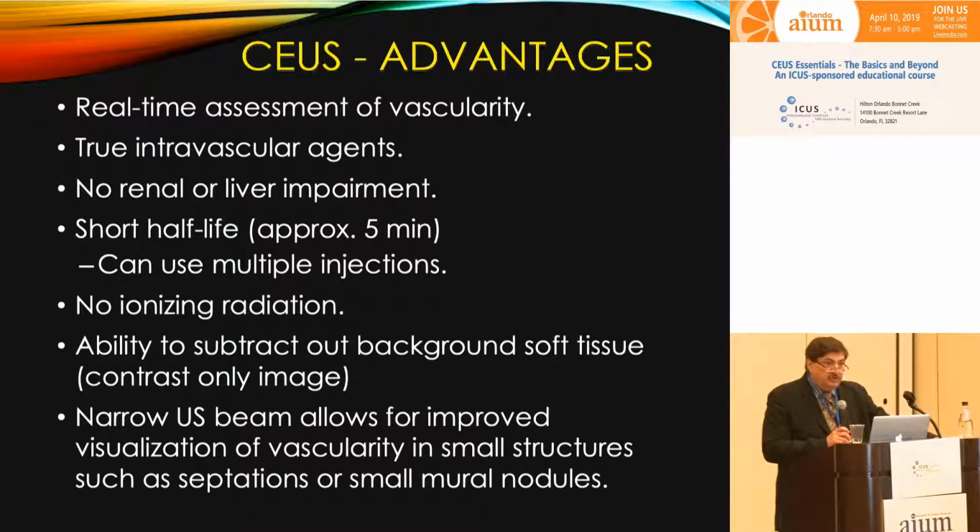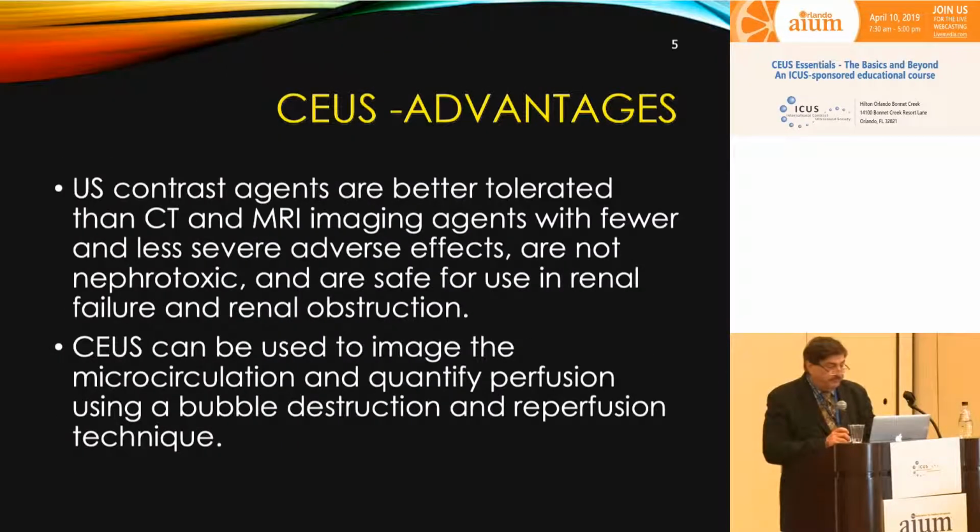And I mentioned this morning the advantages of CEUS: it's a real-time assessment of vascularity, they're true intravascular agents, no renal or liver impairment, short half-life, can use multiple injections, no ionizing radiation, the ability to subtract out background soft tissue, a contrast-only image, and we have a narrow ultrasound beam that allows for improved visualization of vascularity in small structures such as septations or small mural nodules.